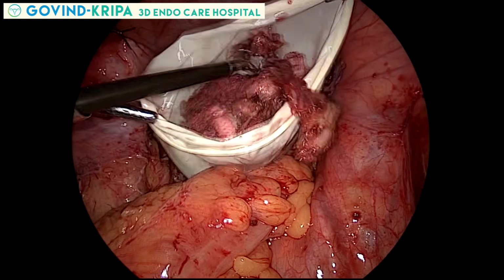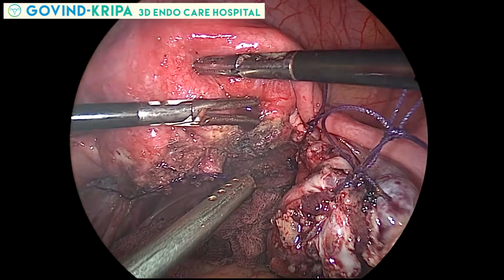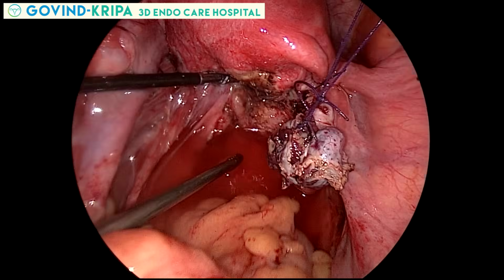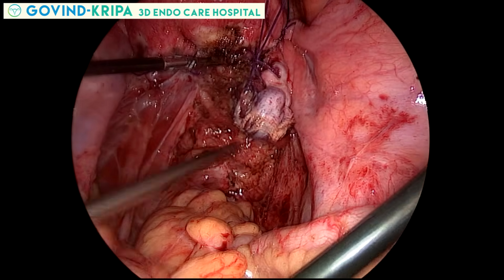Indigenous endobag is used for the specimen extraction. And this is the end picture at the end of the surgery, where there is a complete clearance of the pathological tissue.